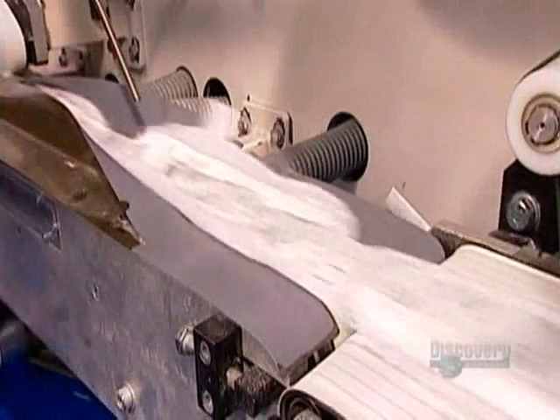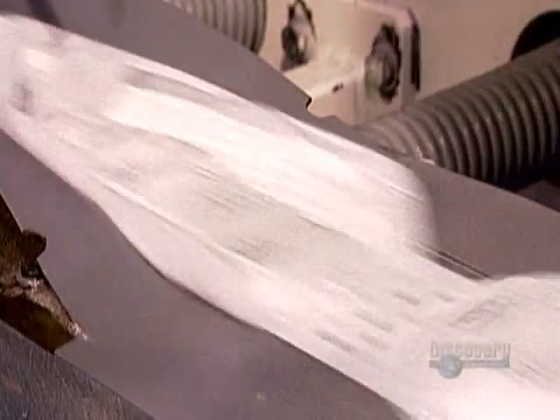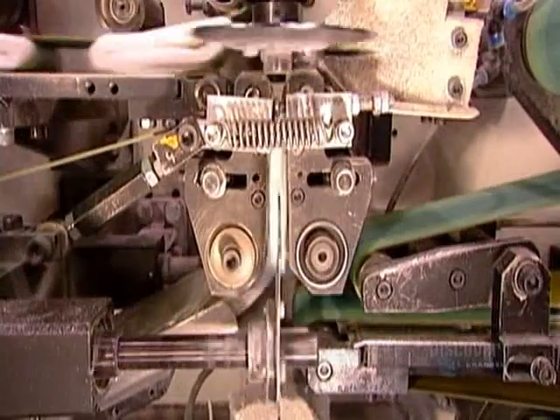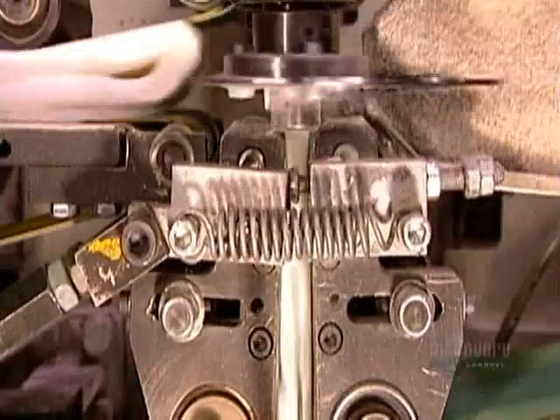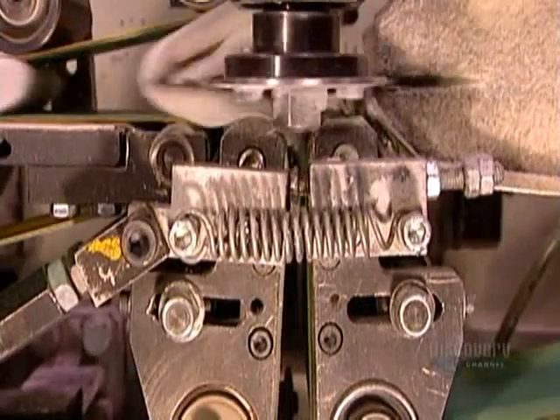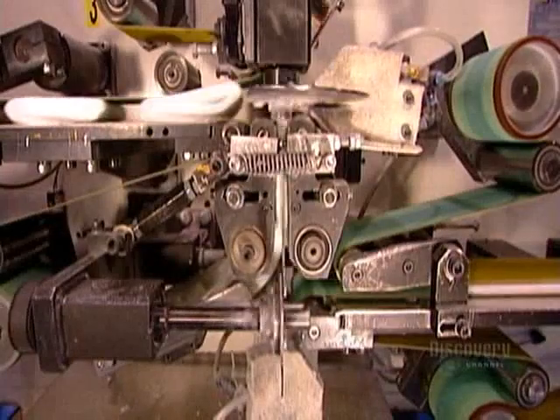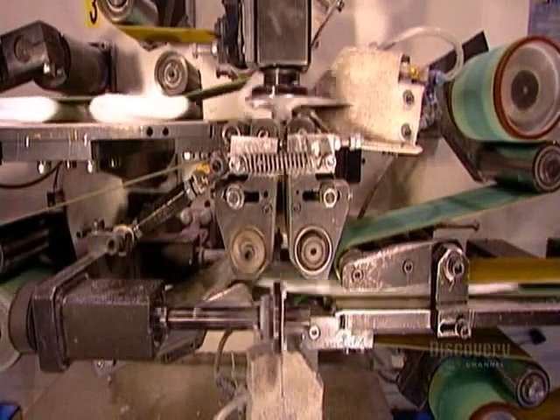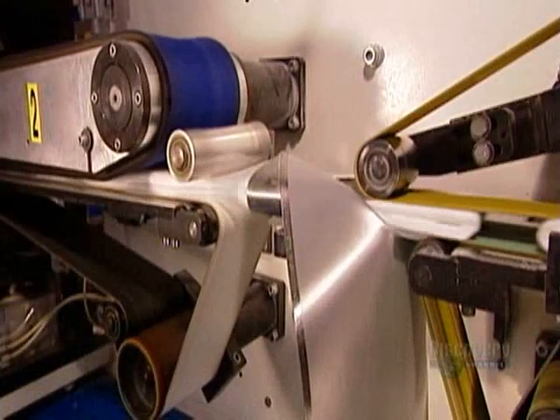Now the pads move on to the packaging line. The equipment first folds over the adhesive wings, then folds each pad in 3. The folded pads now go into plastic wrap.